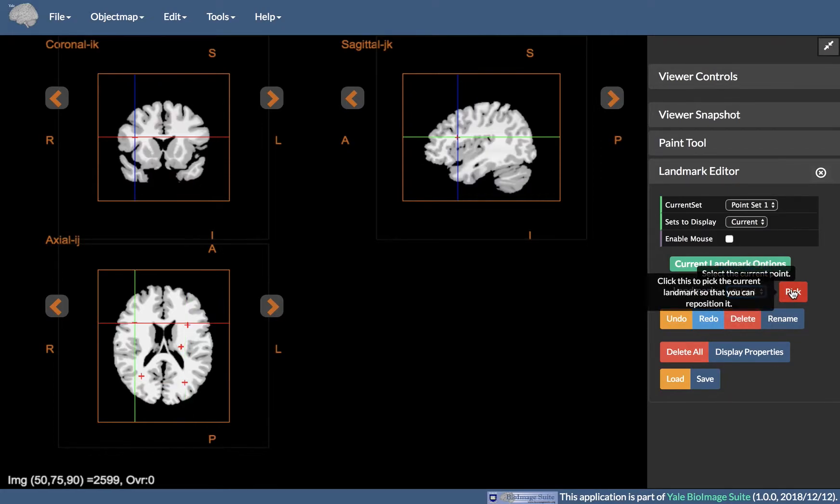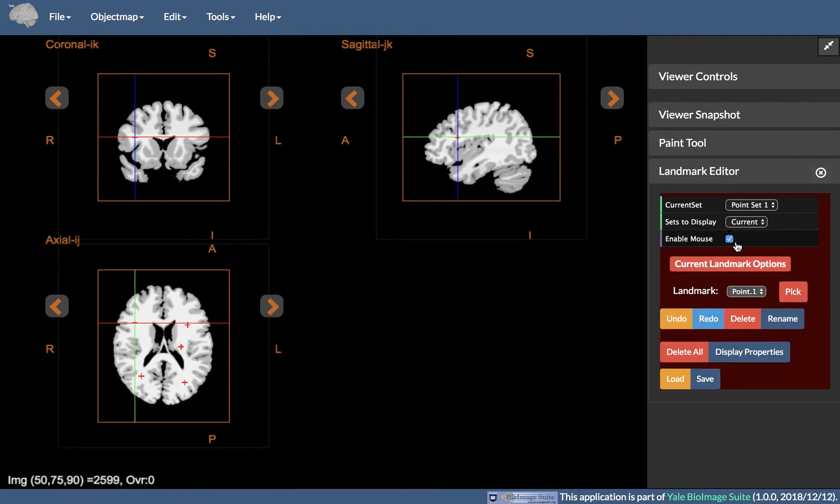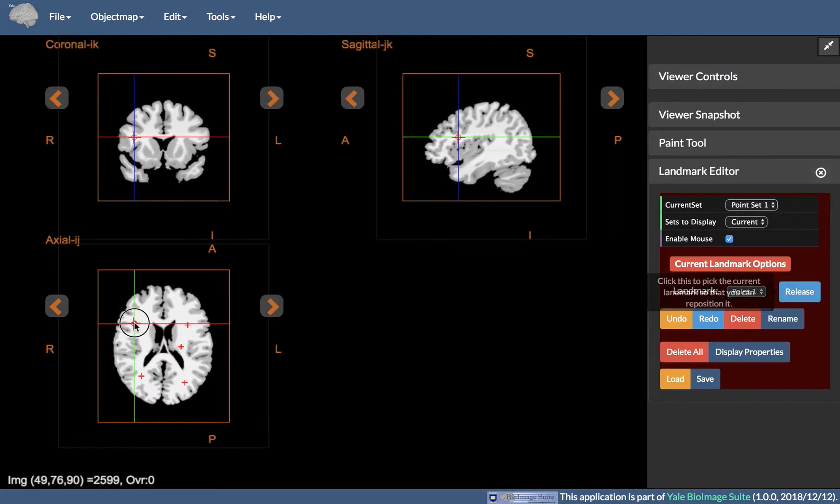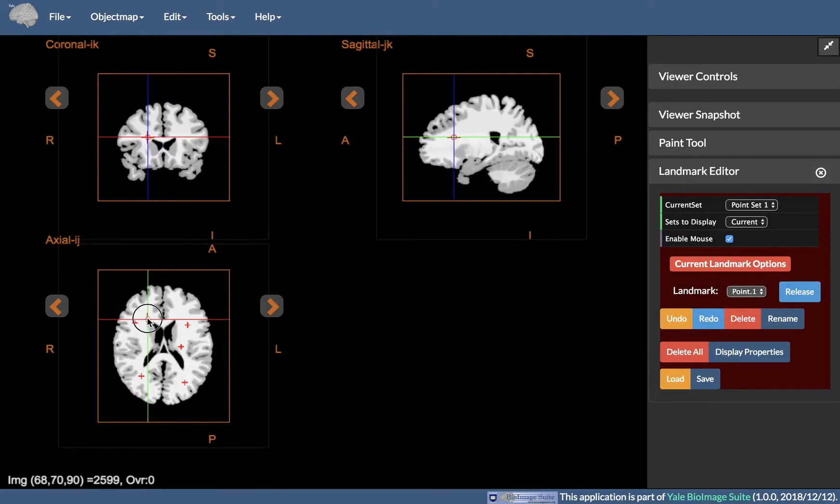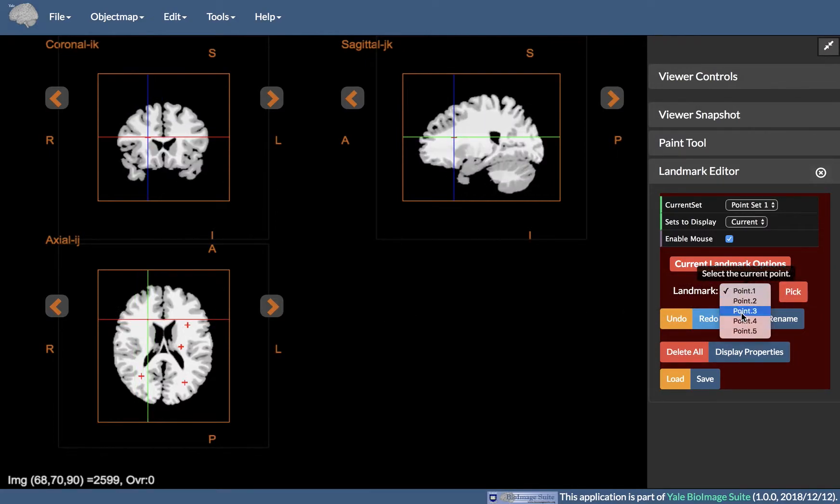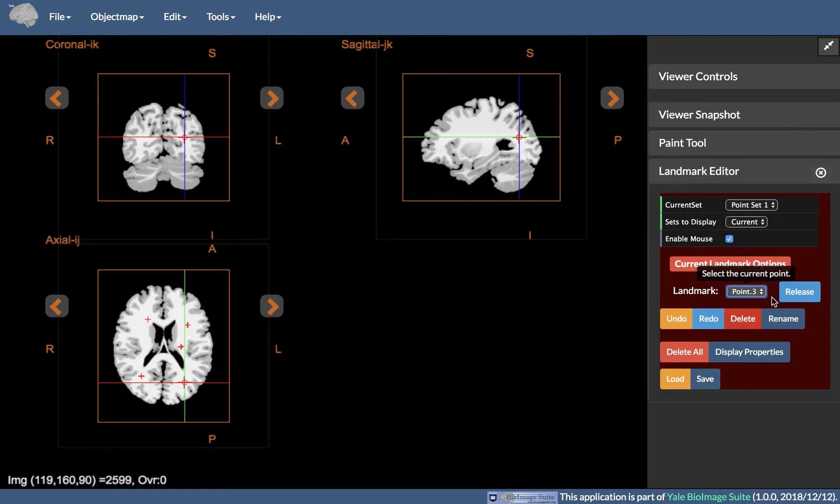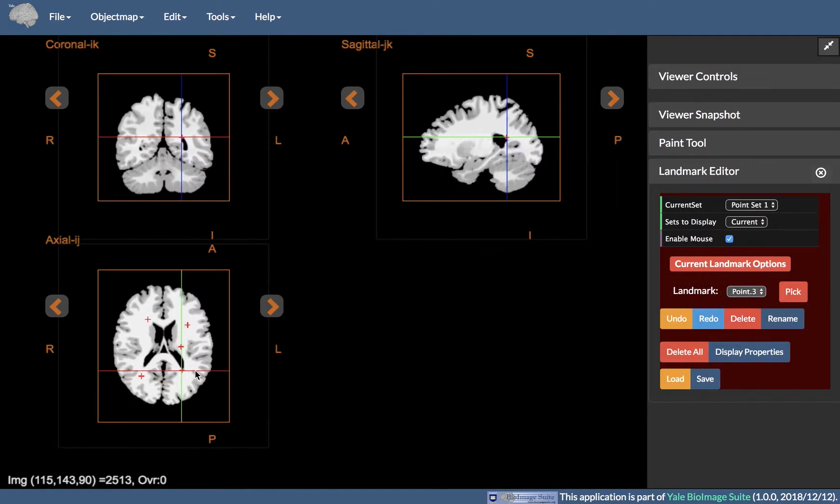You can use Pick and Release, where the Pick button allows for editing landmark locations. If the Enable Mouse toggle is checked, pressing the Pick button will allow the landmark to be moved. A circle will appear around the landmark to indicate that it can be moved.